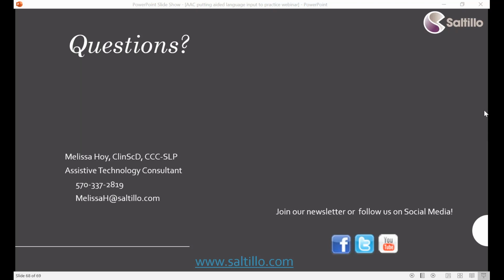One thing to note when it comes to your question about navigating the device. So that's more about how to navigate the device. It really does depend on your device. They're all going to be organized a little bit differently, which is why there are so many out there. A lot of the time, especially with a high-tech system, it is a dynamic display, so every time you hit a button, it's going to change. I wouldn't necessarily say that there's a prompt hierarchy for that.